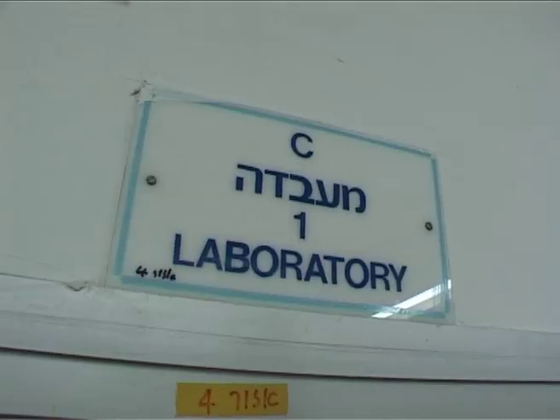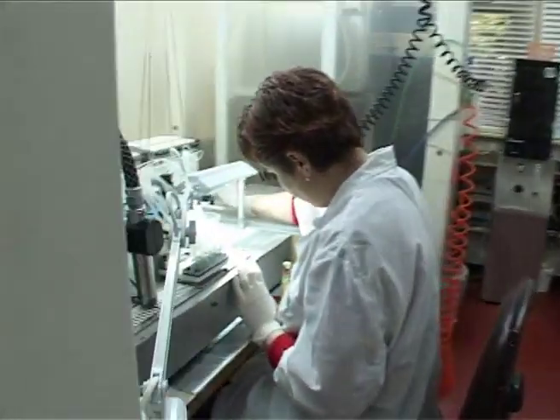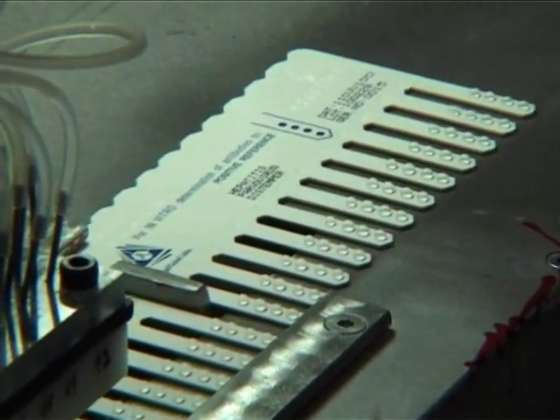One of these kits, the bovine immunocomb, is a portable solid phase ELISA kit for the detection of bovine brucella antibody levels.